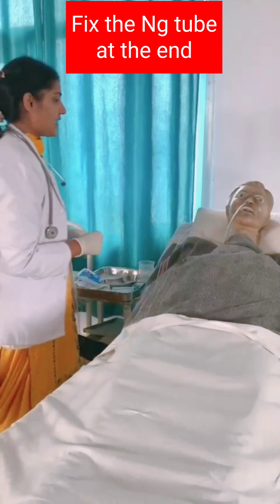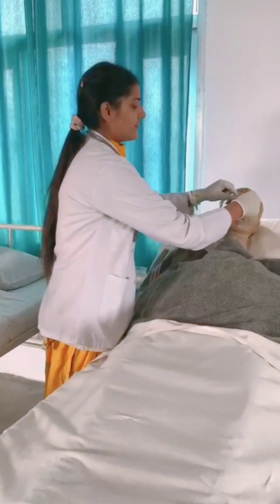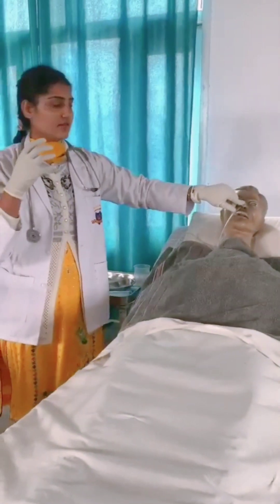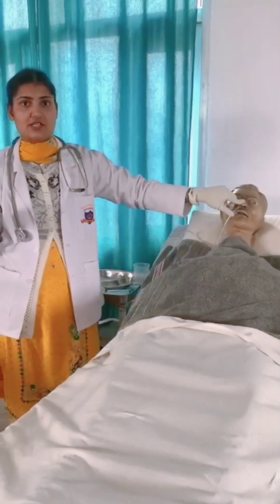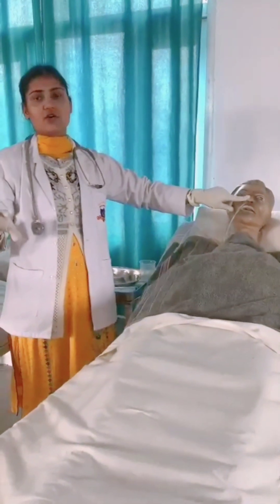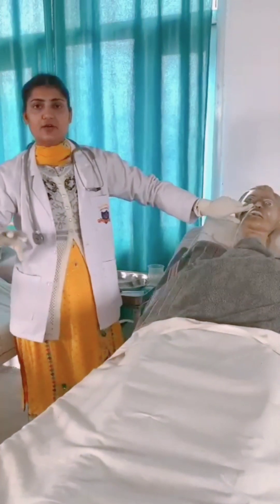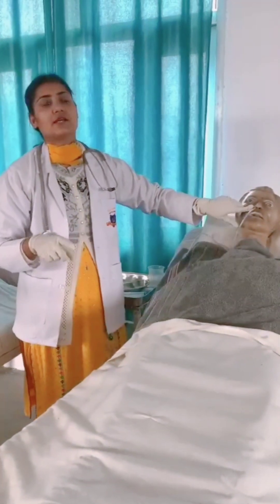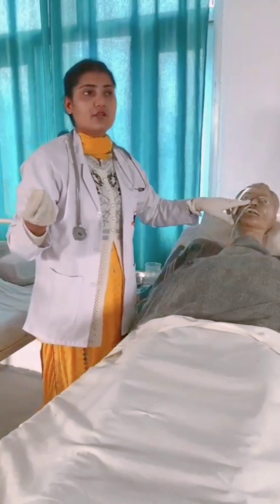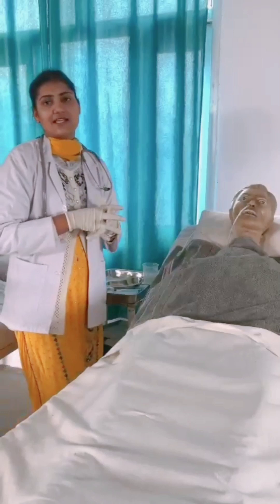Once placement is confirmed, you can apply adhesive tape on the nasogastric tube and fix it to the patient's nose so the patient cannot expel the tube, making it easier for the patient. If a patient is unconscious and has no control over their limb movements, you must fix this tube. Even if the patient is able to understand everything, you still need to fix it, because by mistake they can expel the tube — so fixing it ensures the nasogastric tube will not easily come out.